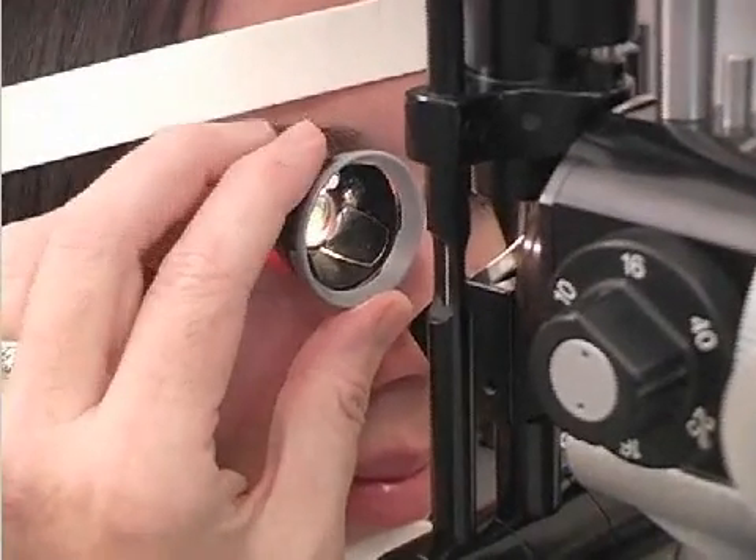I start by looking at the 12 o'clock mirror, which allows me to look at the inferior angle — the deepest and most pigmented portion of the angle. I then rotate the lens clockwise and record the findings in a clockwise manner, 360 degrees around the iridocorneal angle.